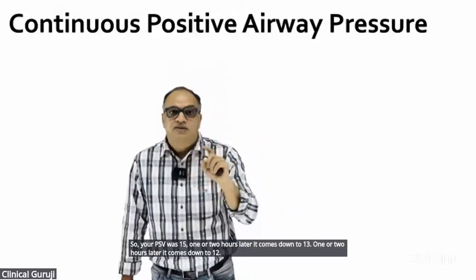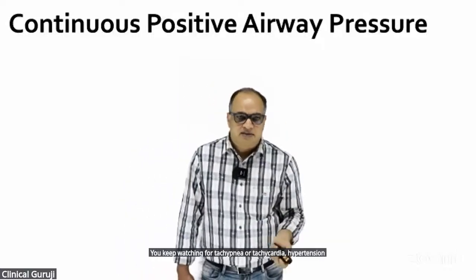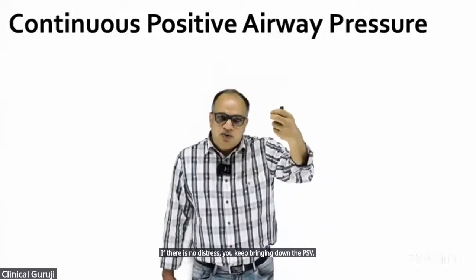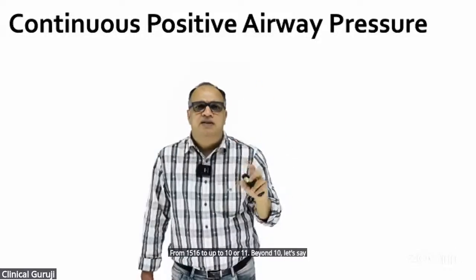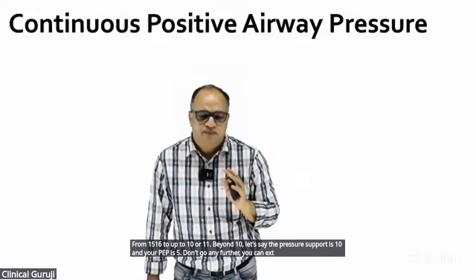You keep watching for tachypnea, tachycardia, hypertension or any kind of distress. If there is no distress, you keep bringing down the PSV from 15, 16 to up to 10 or 11. Beyond 10, let's say the pressure support is 10 and your PEEP is 5, don't go any further, you can extubate from there only. Right?